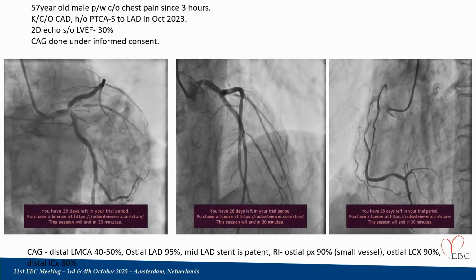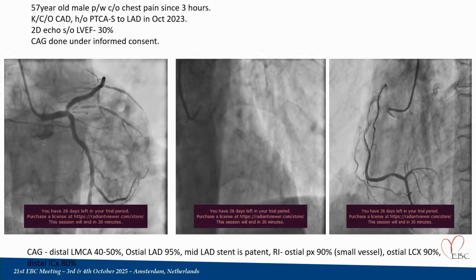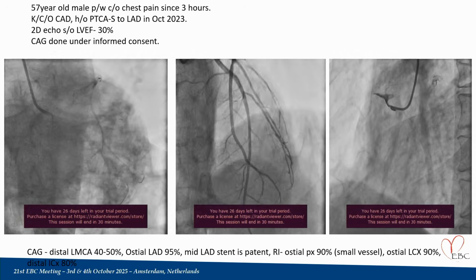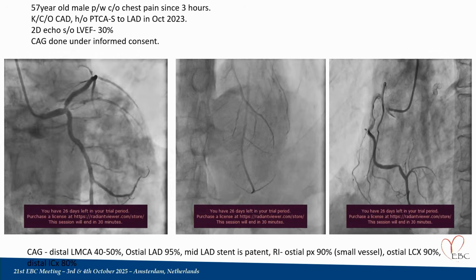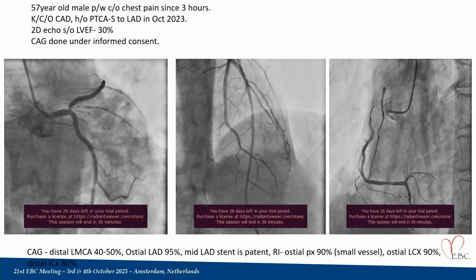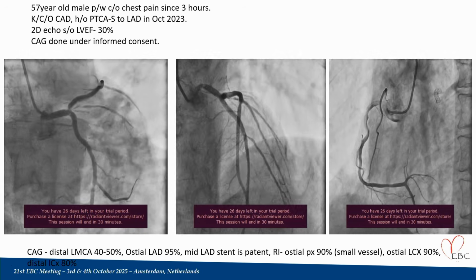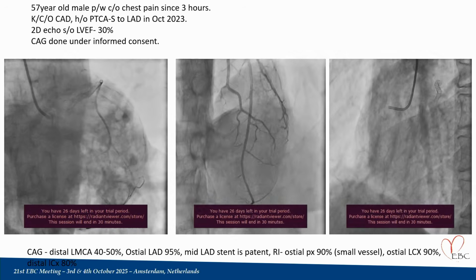So now we thought that we need to do imaging in this case so as to find out the cause for development of this disease at the left main bifurcation, as to what is happening. And probably on the angiogram itself, we can see that there were some stent struts hanging back into the left main. That is probably the previous operator might have tried to nail the ostia in this case as well.